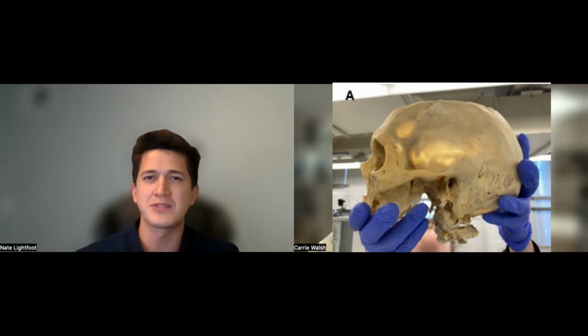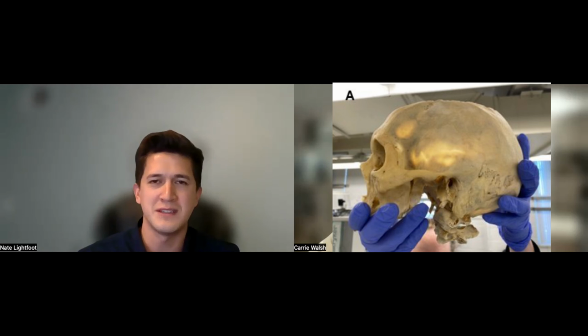Yeah, so using B mode, typically the natural thickness of the skull leads to its inability to be insonated. But with B mode ultrasound, depending on the thickness of the skull in the patient, sometimes you can get a good view of the brain. And so you could see some simple structures like the ventricles and the sulci of the brain, as well as midline structures, and also get an idea of the CSF spaces as well.